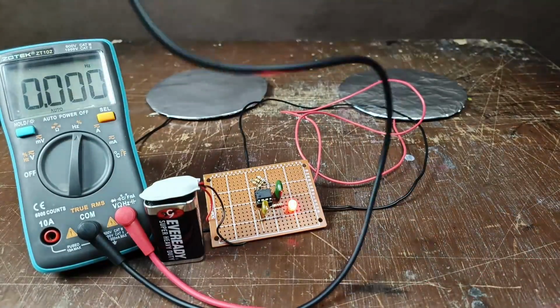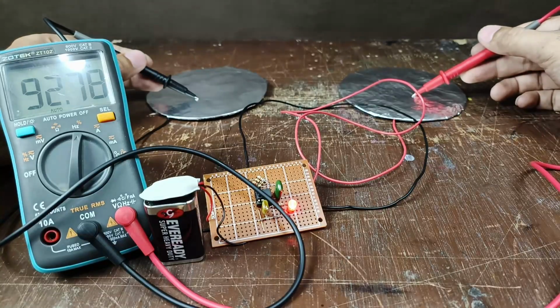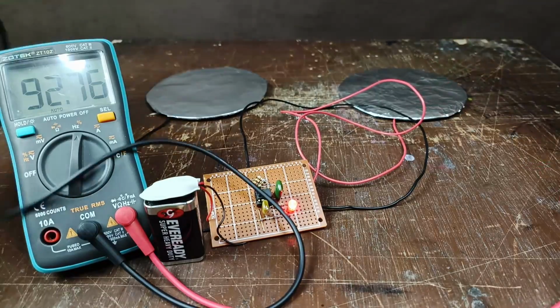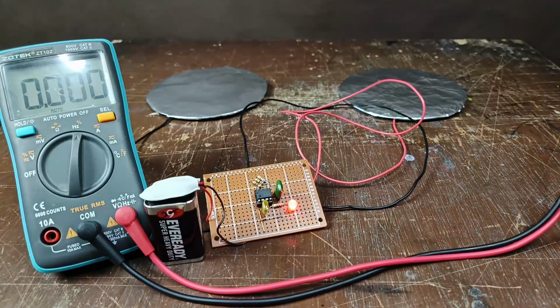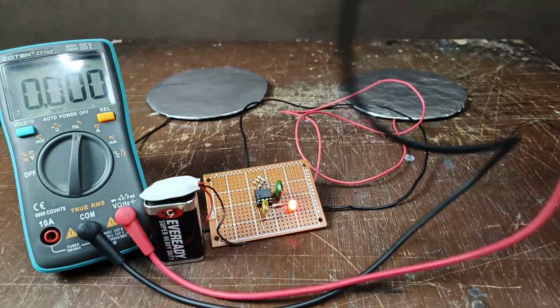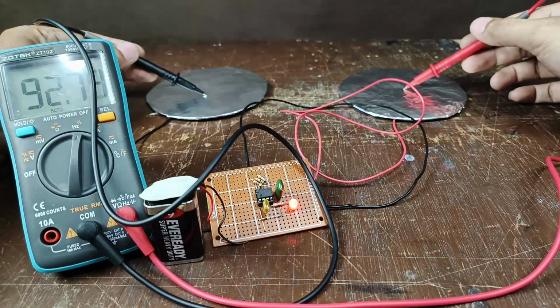Now let's check the frequency. 92.7 hertz. That's the frequency. Again, 92.7.